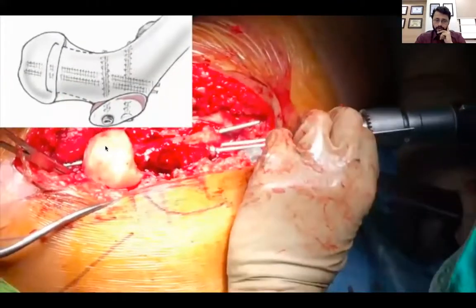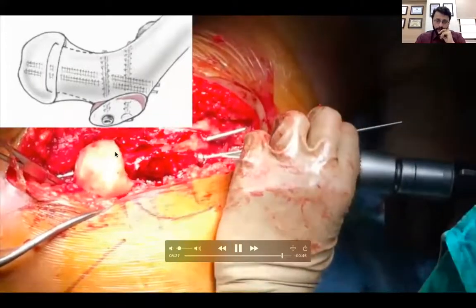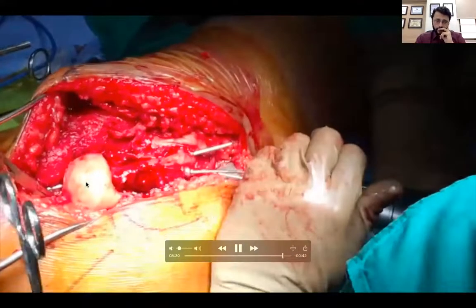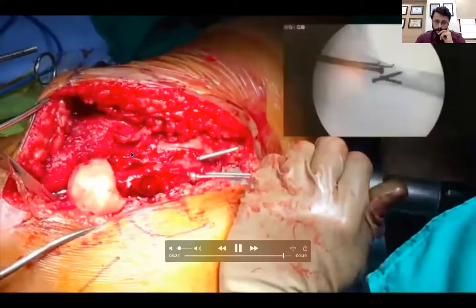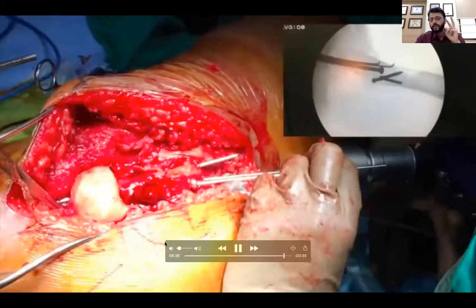This is checked on C-arm that the position and the reduction is absolutely fine. After which we remove the pack and then put the femoral head back in and fix the trochanter with two 3.5 mm screws.